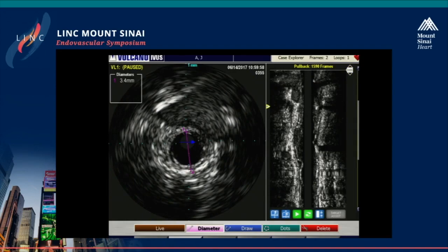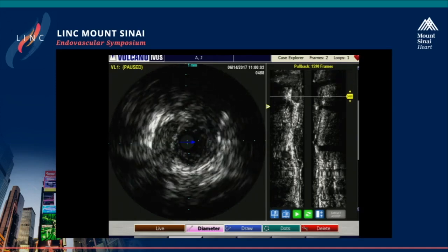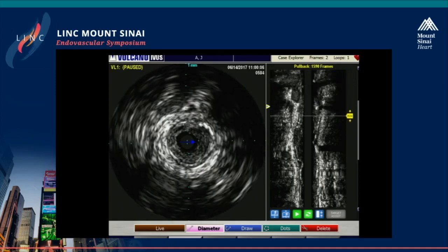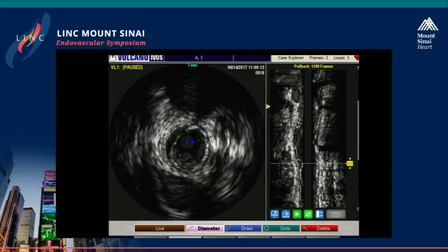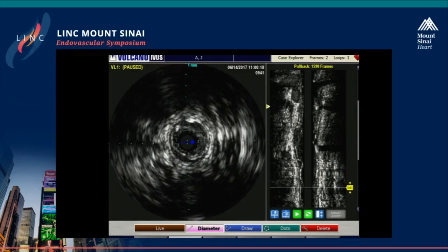How about the rest of the group? Give me the directional. I would agree with you. I do laser atherectomy, then POBA, then take a quick look, and then probably DCB plus or minus bailout stenting with Supera if you have a bad dissection.